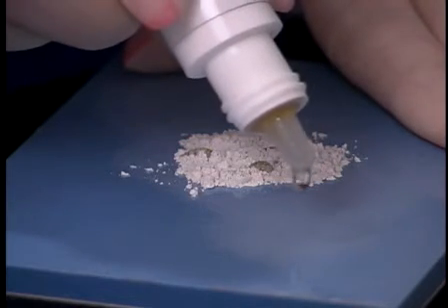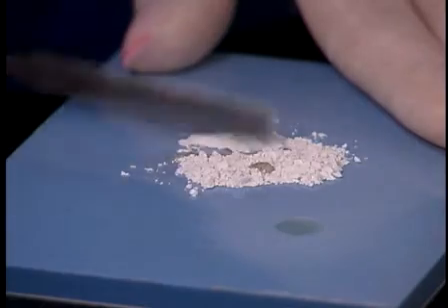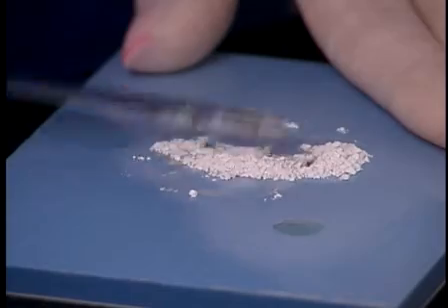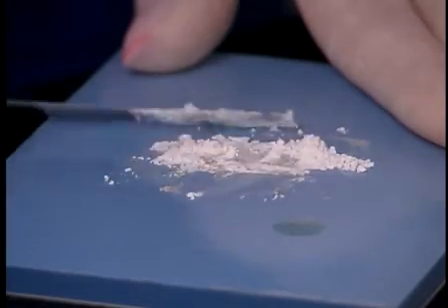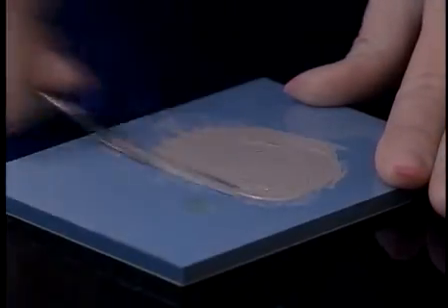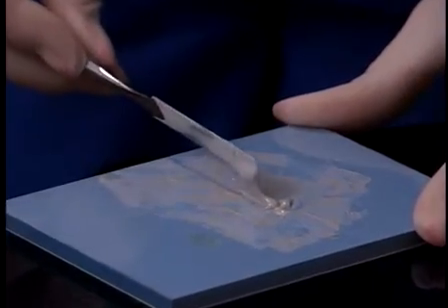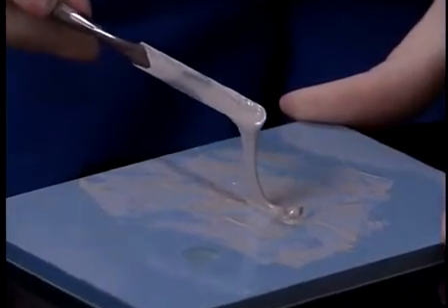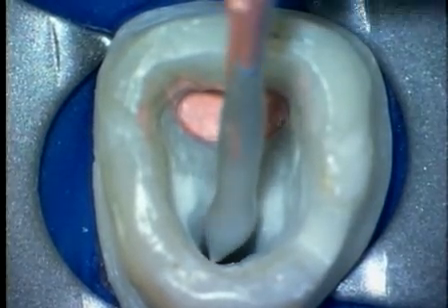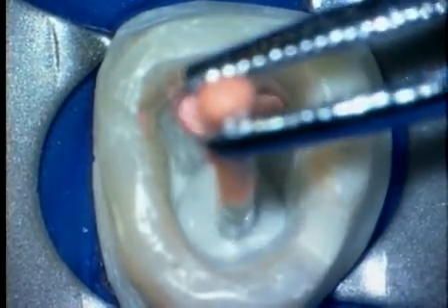A drop can be placed on the side if we want to decrease the viscosity. On the other hand, we can use 2 drops of liquid with 3 shovels of powder in shorter routes with more open canals. The assistant uses vigorous action and a wide surface area to combine the powder and the liquid. When properly mixed, you can pick the sealer up about 1 inch without it cascading back to the pad. Following drying the canal, the pre-fitted master cone is buttered liberally, and the cone is slowly and carefully teased to place to prevent cement from being displaced periapically.